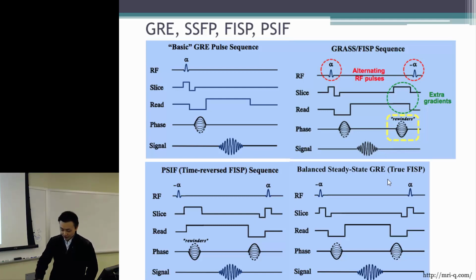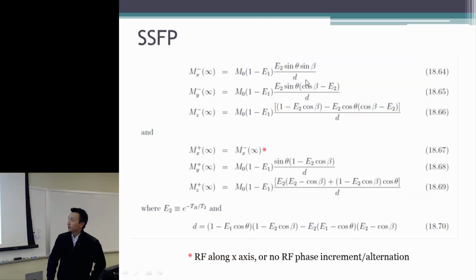So yeah, this is just a side note so that you know that there are different sequences associated with this SSFP. Here is the expression for the SSFP signal. It's very complicated, so we are not going to go through this one. Here is just describing the magnetization components before the RF pulse and after the RF pulse.